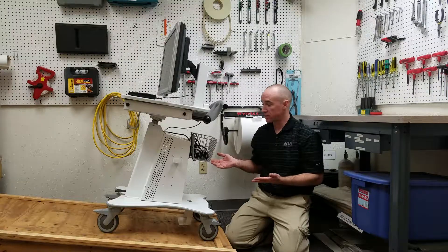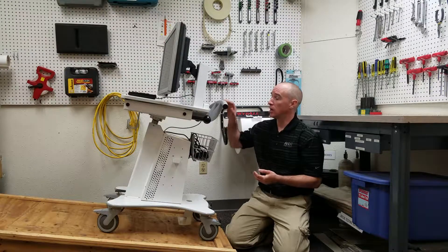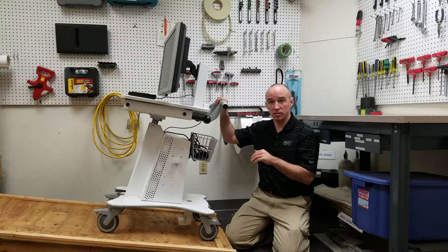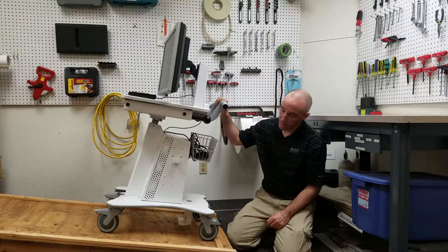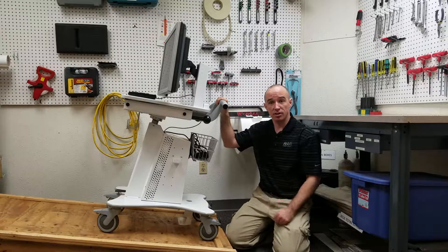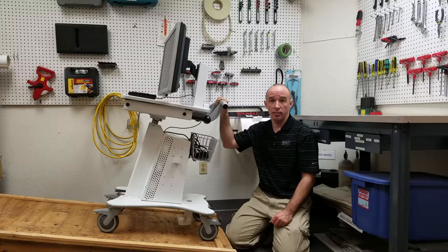Here is our cart. It is in transport mode, which is called out in the instructions for use documentation. It has an adjustable height working surface, so it's in its lowest position. Its directional locking wheels are locked. Our incline is at 10 degrees, and we're going to make sure that there is no creepage or slip more than 50 millimeters.